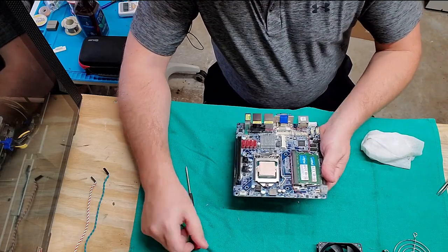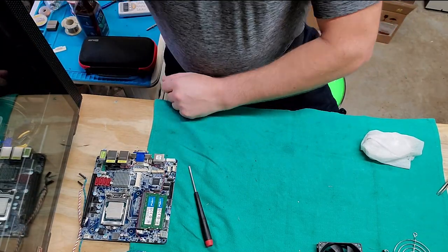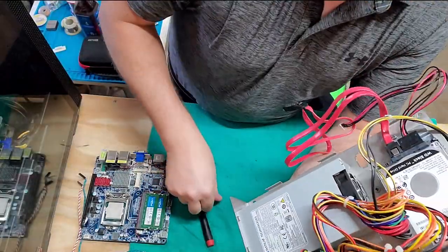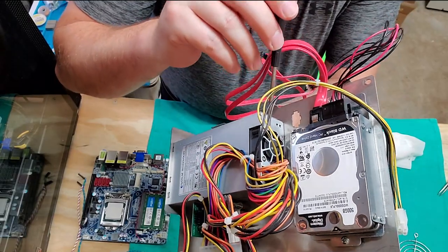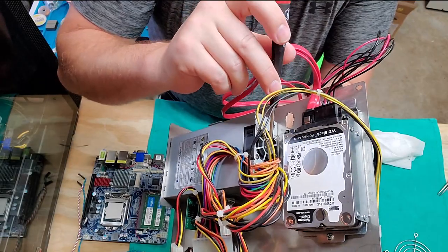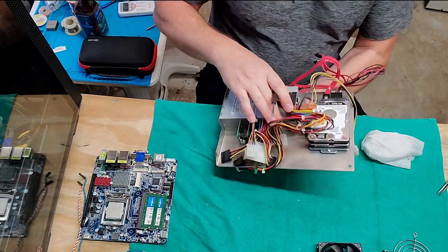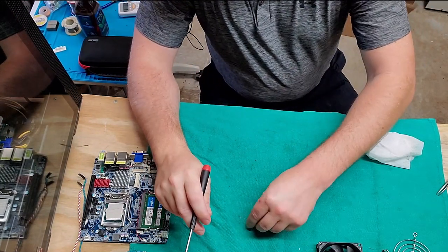Maybe hook it up to a proper power supply, that little 1U power supply. This guy right here. It's a fully featured power supply. Doesn't smell like it's bad. Normally power supplies will definitely give you a smell. And also there's a forced air induction on it, so you want to make sure that the bearings on the fan are good. You can easily do that by just prodding at it and seeing if it has a temptation to spin, because if it's resisting spinning, then that means that your bearings are going bad and your power supply is boogered up, so might as well just toss it.